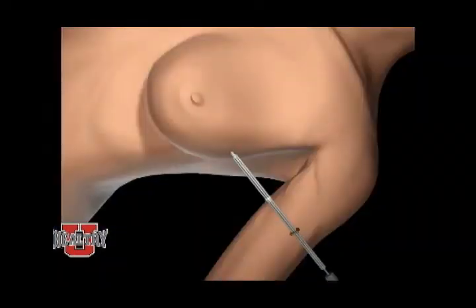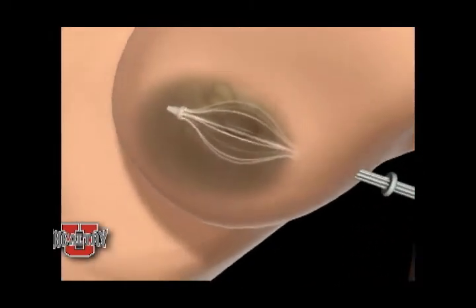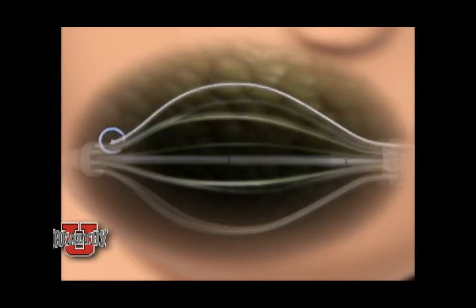What you're seeing on the screen now is a device called SAVI Brachytherapy, which we're the original pioneers of. And it looks like an egg whisk, but really it's a radiation delivery catheter. And there are multiple struts. On this one, you can see that there are 8 struts. And the dose can be sculpted and just treat what we need to treat, because each one of those catheters or struts is individually loadable with that radioactive seed.